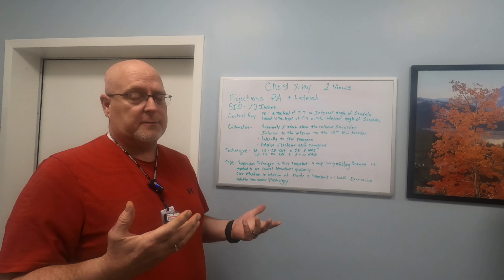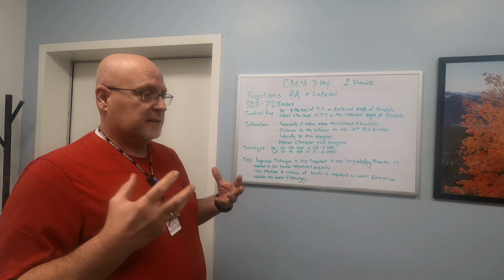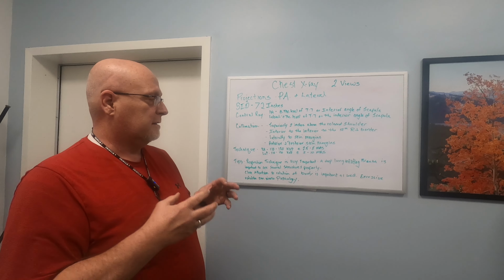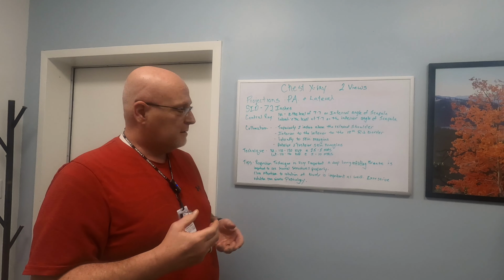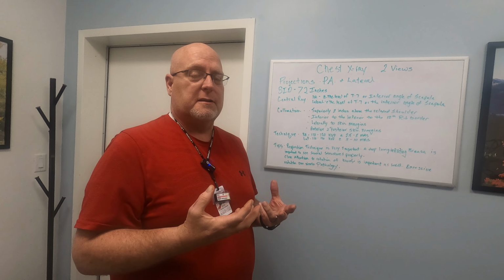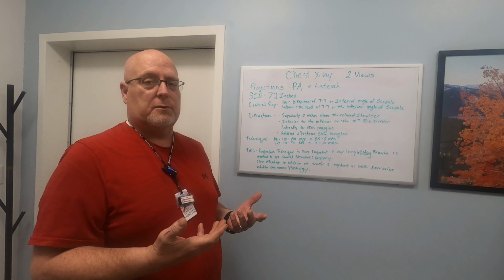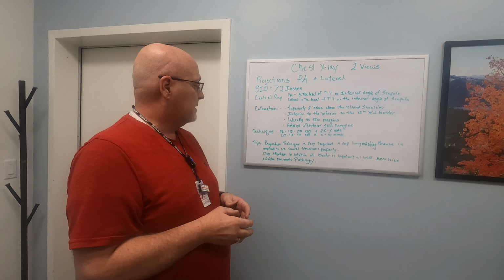Okay, breathing techniques are very important with chest x-ray. We need to take a really deep breath in so we can inflate the lungs, so we can see the lung tissue well. And also, we can see several structures properly if we have a good breath hold. So, respiratory is very important.